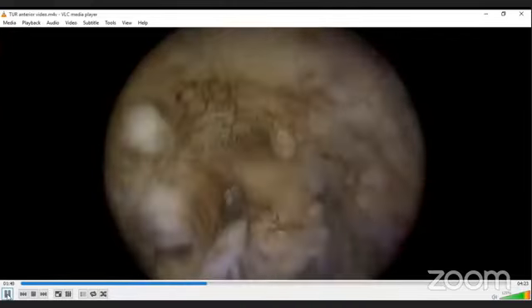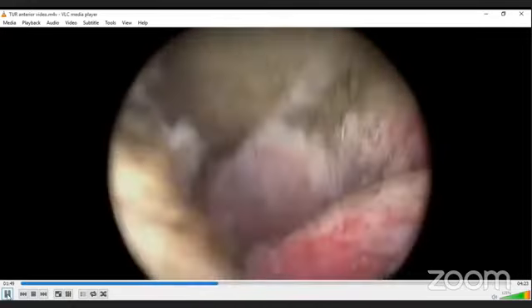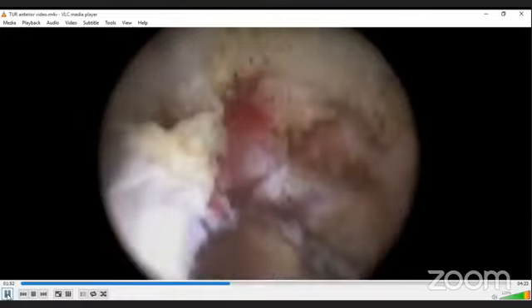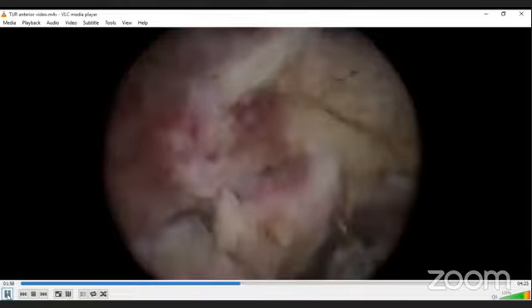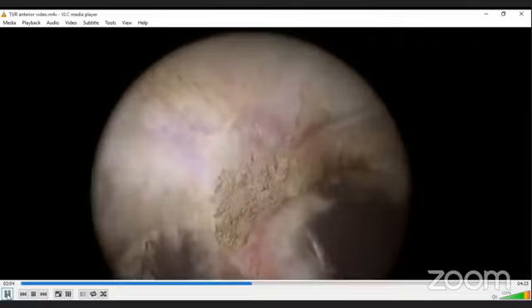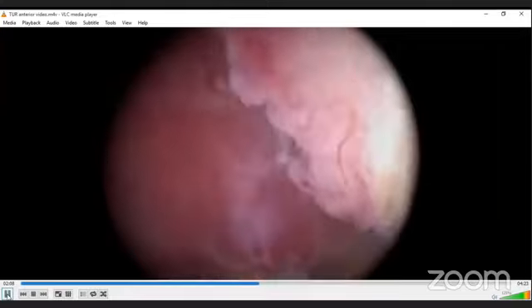If we see the tumor which is too large, we can take full loop cuts, and if we see the tumor which sometimes may be just carpet like, we have to use the tip of the loop to cut in monopolar. So sometimes during the cuts, this was a large tumor and almost the movement is not realized a little. But as we are going deep here, there is a pressure which has to be kept on the lower abdomen sometimes to bring the contact of the loop with the tumor.